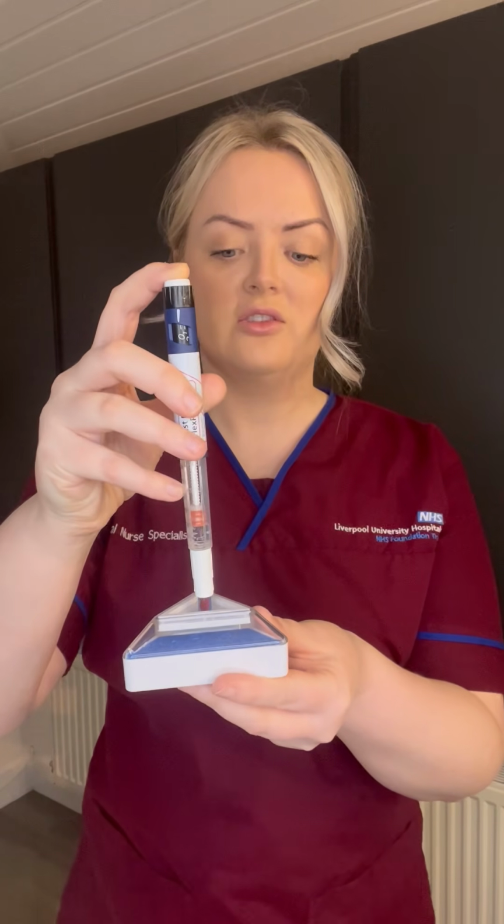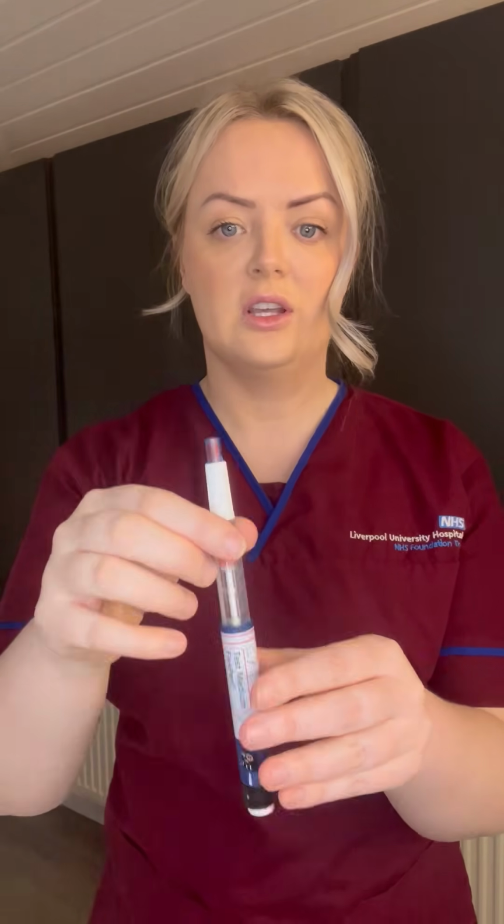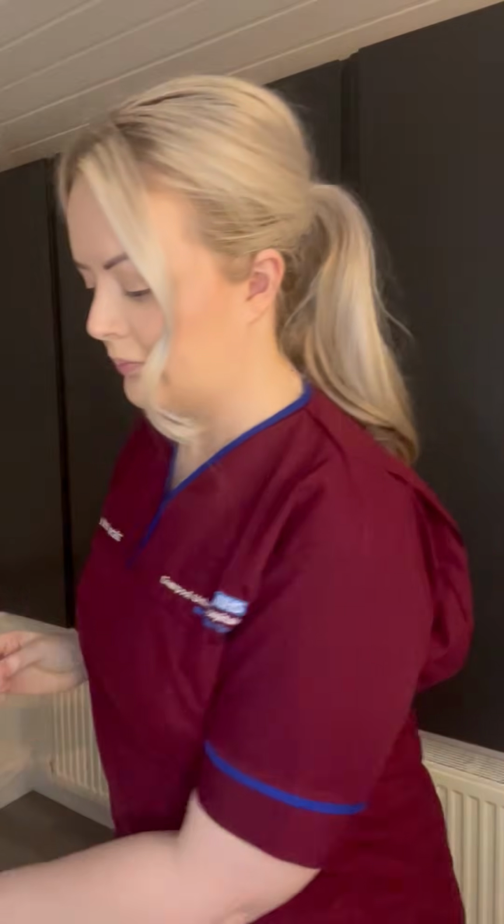And what you want to then do is release the needle away from the skin. So you can see now on this safety needle that there's a cover come over the needle, and this cover is red, and that will stop any sharp injuries. And then what you can do is remove the needle off the pen as such and pop it straight into your sharps bin.